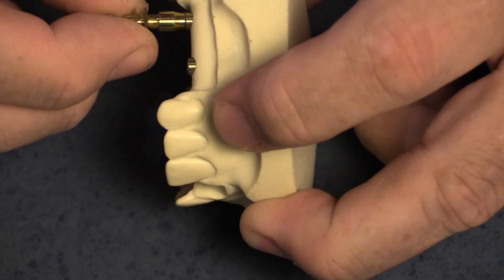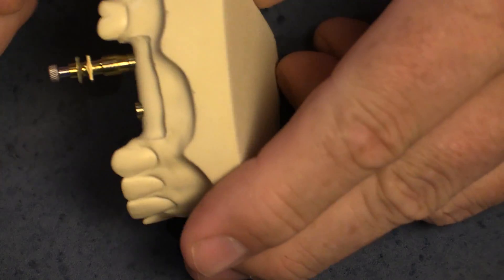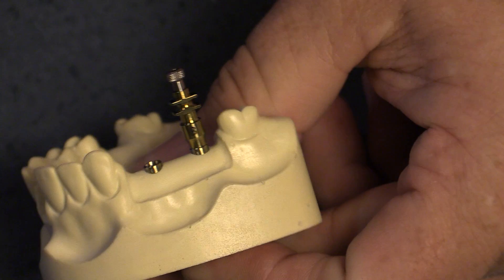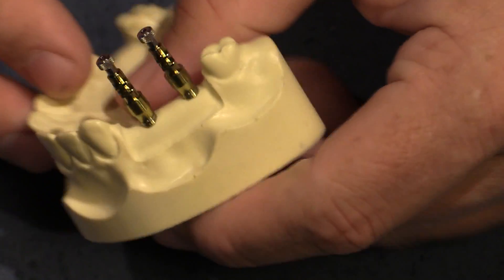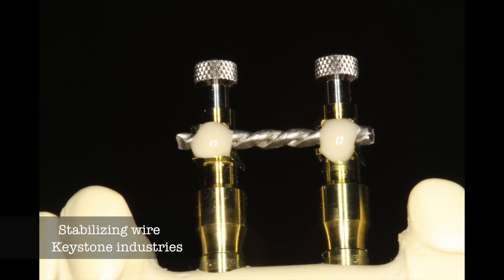Since these are non-hex, they'll spin around a little bit, so you have to hold and orient them, but they're very easy to seat. You'll see this one is also flared, so we want some emergence profile on the bridge and we're using flared impression copings to create this effect. After taking an x-ray to confirm where they're seated, I'll use some stabilizing wire from Keystone Industries and then stabilize them with some resin.